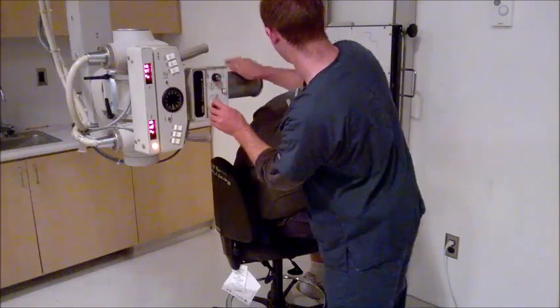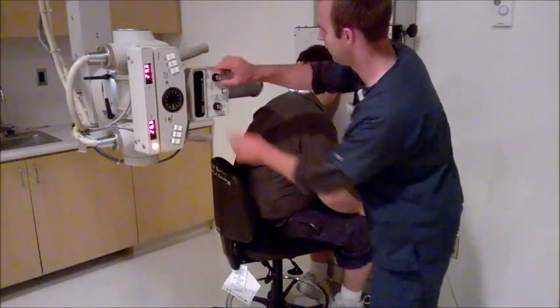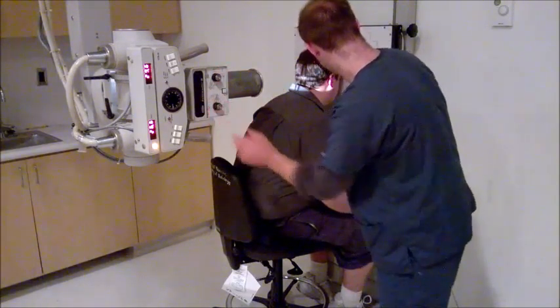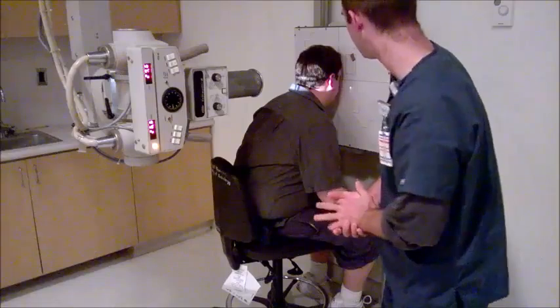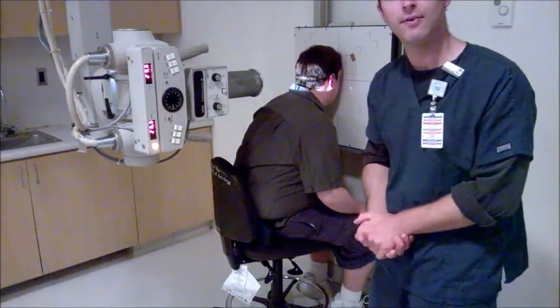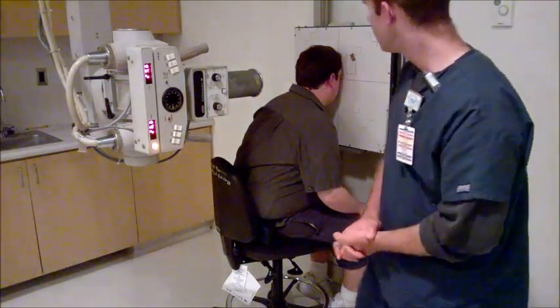Now what this tube right here, the collimating tube, does is reduce scatter. So that's what I have the orbit for. So keep it just like that. And my technique would be 65 kVp at 20 mAs. All right, I would take this deep.